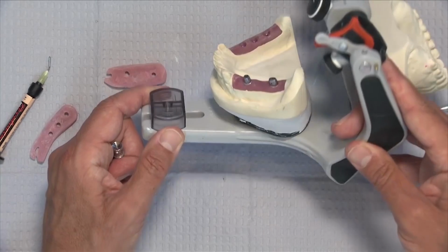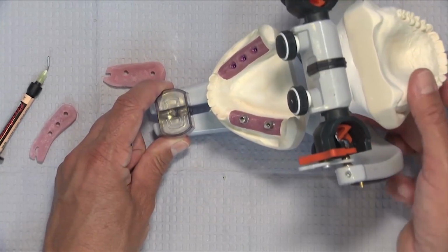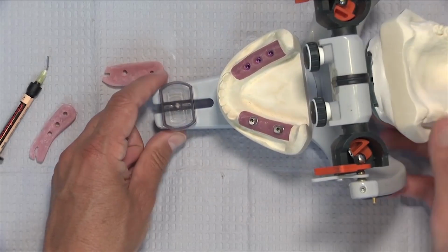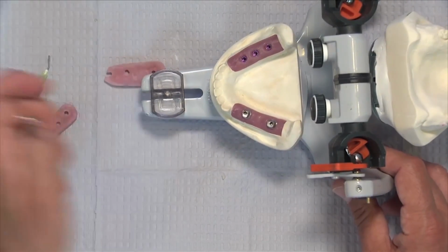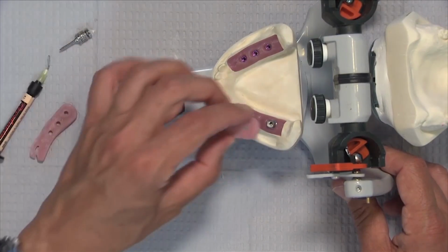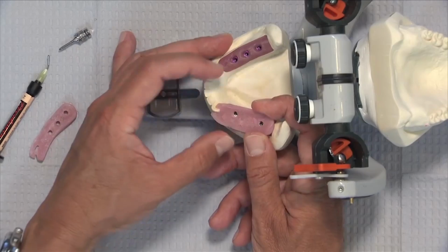And so digital radiographs are a fantastic way to verify that we're seated all the way, because if we're not, we're going to have problems with occlusion down the road. We're going to have problems with the draw of the bridge. So assuming this was a patient, we would take a radiograph and in fact verify that they were down all the way. And now we're going to put our index back in place.